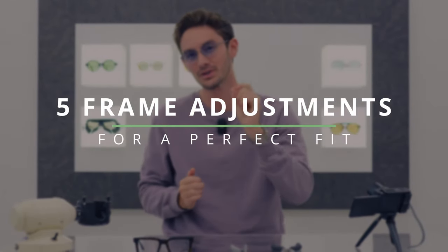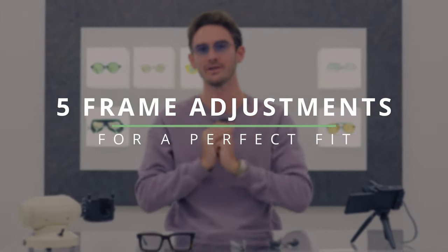Getting the fit and feel of your frames just right is essential to having glasses that you love to wear. In today's video I have five key adjustments to make your eyewear fit perfectly. I'm Robert, Style and Vision Consultant here at the Spectacle Factory, and it's my job to pair you with your perfect pair of glasses. Very few glasses are absolutely perfect off the shelf.